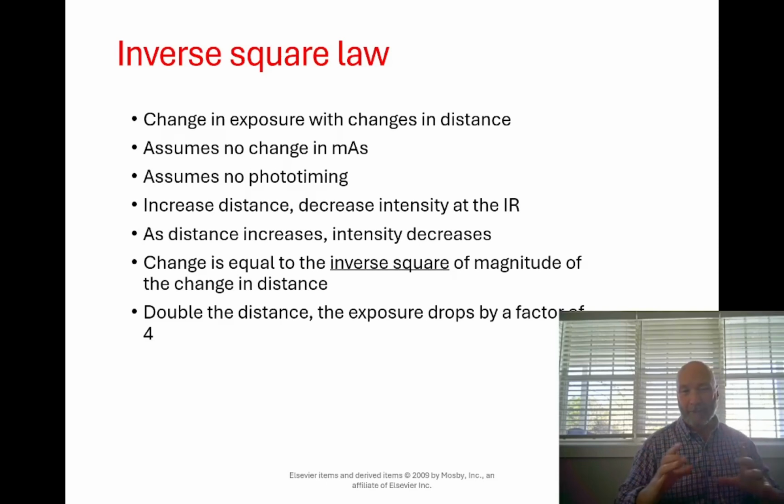And you're kind of right in that if you double your distance, you go from 40 to 80 inches, then that 4-inch square is going to spread out, but it's going to spread out in 2 dimensions. So it's going to double, but it's going to double in 2 dimensions. So instead of having, let's say I'm making an exposure and I'm just wanting to make an exposure of my heart, all right? And some will say I don't have a heart that's any bigger than that.